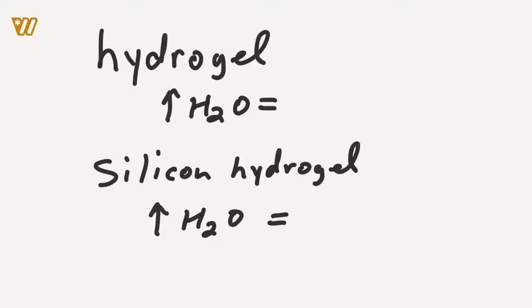Now let's talk about gas permeability and soft contact lens materials. The key thing that I want you guys to take home is there's a box here that talks about how in general oxygen permeability depends strongly on water content. And so what I want to talk about is comparing hydrogel contacts to silicone hydrogel contacts. So if we have a hydrogel contact lens and we increase the water content, what does that do to the oxygen getting to the cornea? That's going to increase O2 to the cornea. It's going to increase oxygen to the cornea. And you guys can highlight that in your text. High water content is high permeability or higher Dk. So if you increase water in a hydrogel, that's going to increase oxygen to the cornea.